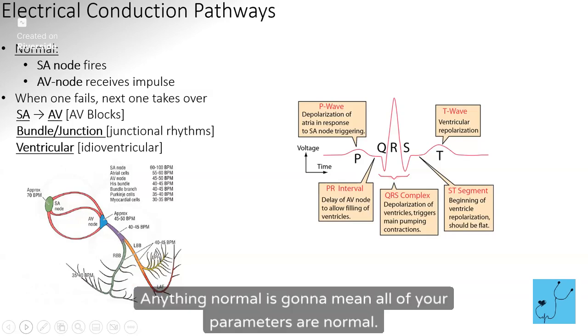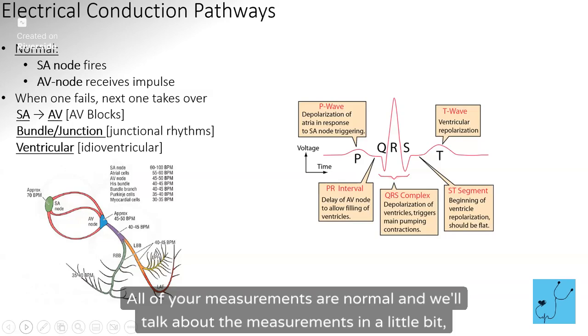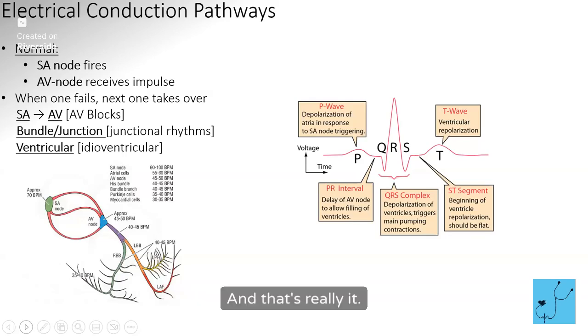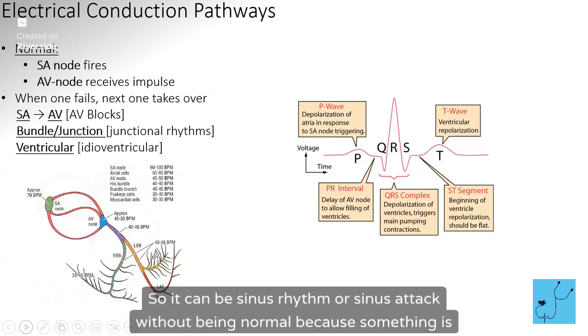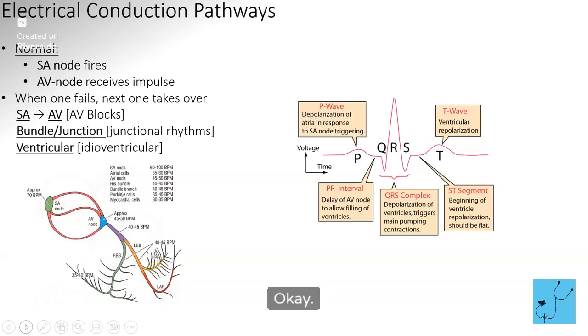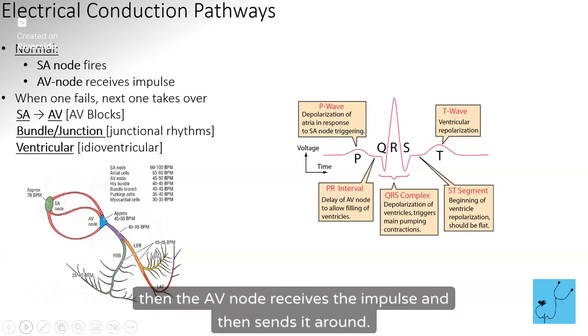Anything normal is going to mean all of your parameters are normal. You have a P for every QRS. All of your measurements are normal, and we'll talk about the measurements in a little bit, but all of your measurements in seconds are within a normal range. And that's really it. That makes something normal. So it can be sinus rhythm or sinus tach without being normal, because something is outside of those normal measurement parameters, okay? So normally we have the SA node fire, then the AV node receives the impulse and then sends it around.